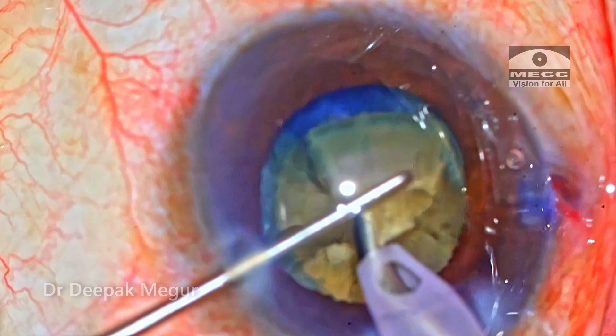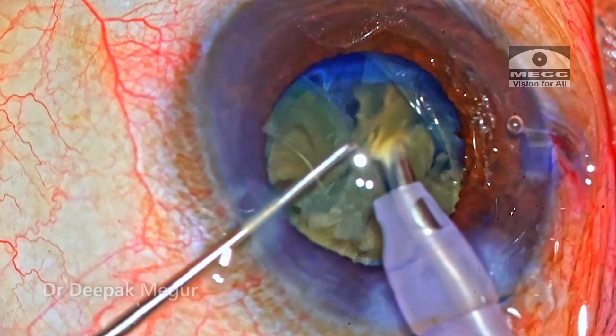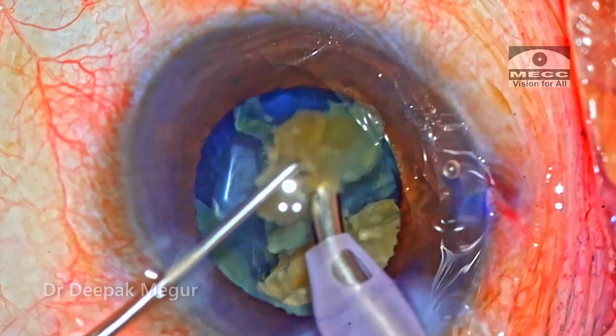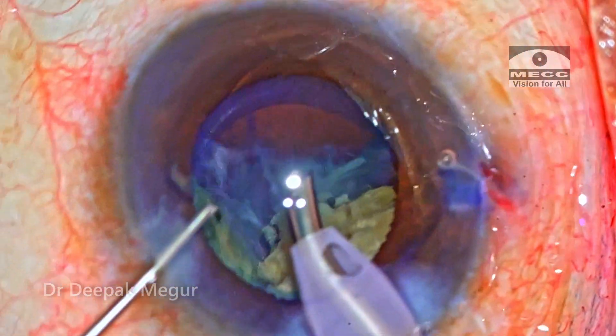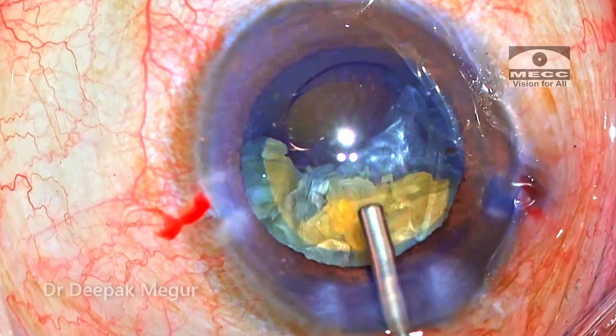As the nucleus is being divided and the fragments of the first heminucleus are being emulsified and the bag is getting emptied, I can still see the shimmering reflex of the distal posterior capsule here. So it looks all right. Once half of the heminucleus is emulsified, I'm injecting already and trying to rotate the second heminucleus.